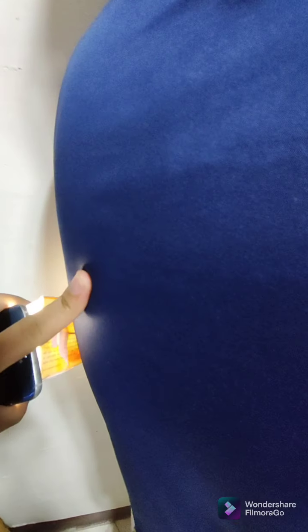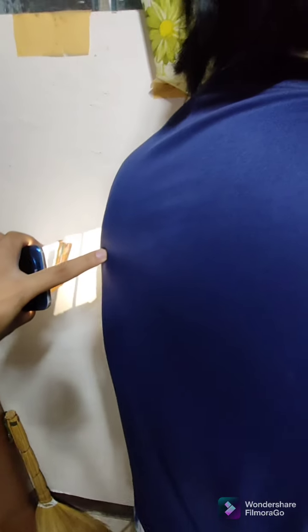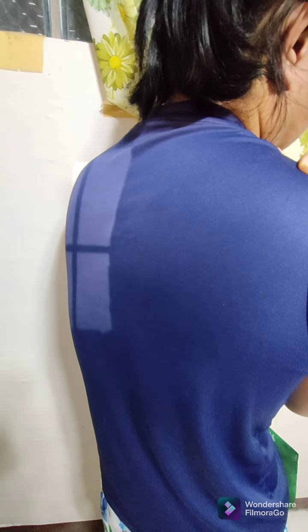And then for the central ray, the CR should be directed towards the mid-vertebral portion of the scapula. So, paano ba natin yan siya mapalpate? Paano ba natin malalaman saan banda yon? So, dito banda. You can see here. Palpate ko ito dito mo, sir, ha? So, makikita natin itong ridge dito. And dito siya exactly banda. Dito. So after palpating, center na natin ang beam natin.